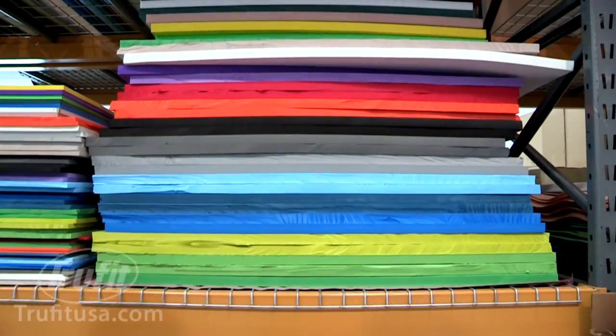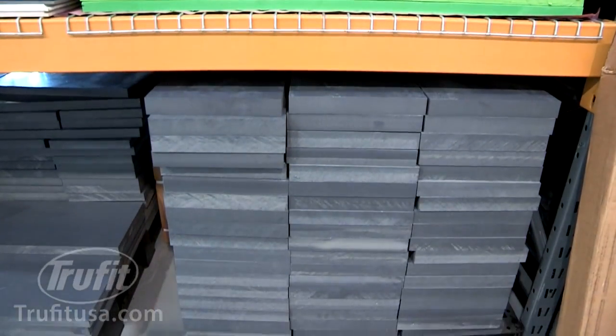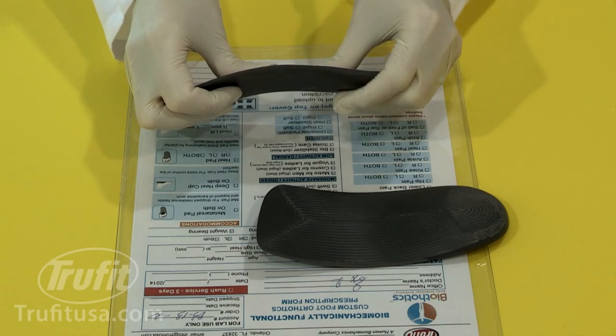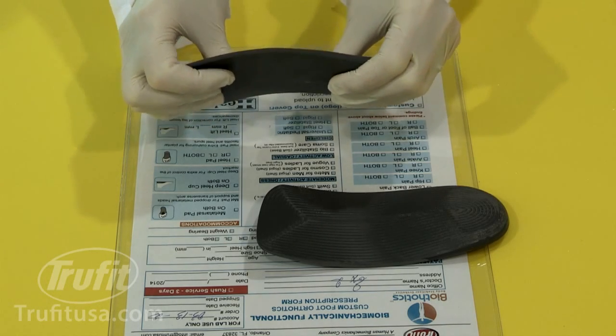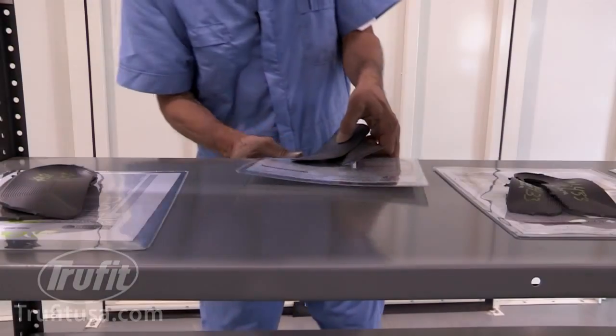The proprietary materials which are used for rigid orthotic shells are a specially developed combination of various polymers which provide the perfect balance of flexibility, rigidity, memory, and shock absorption.